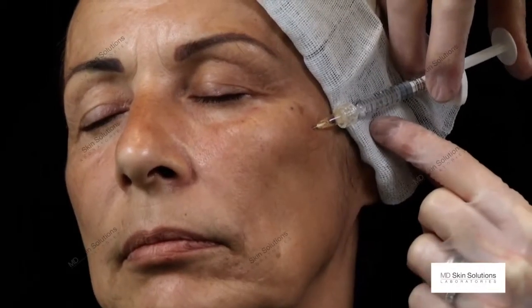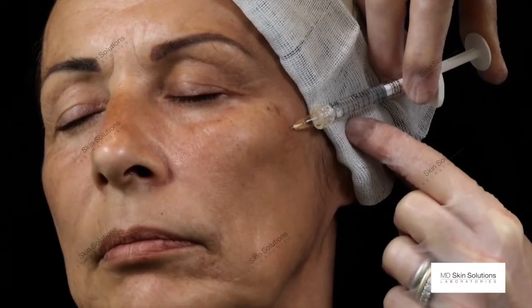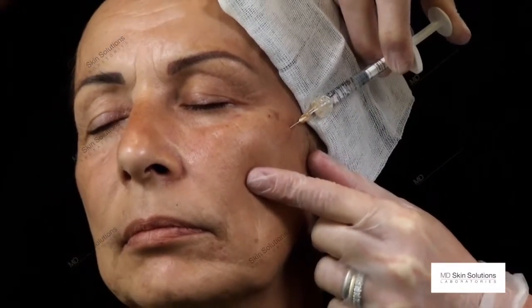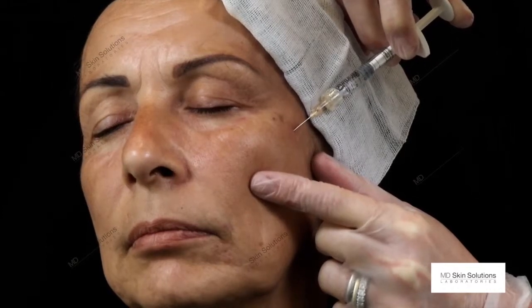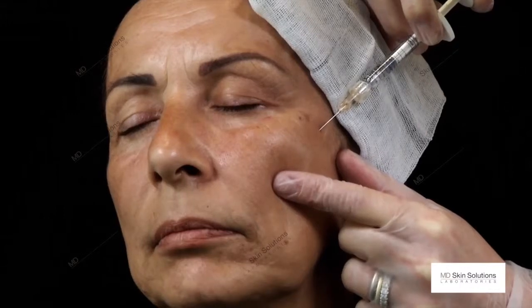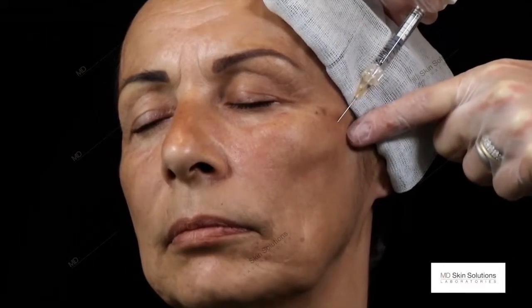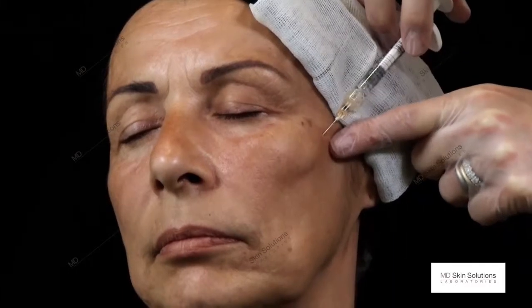I inject 0.1 as a bolus, and now I withdraw the cannula and the syringe while injecting Pluryal volume in a retrograde way in order to redefine her lateral OG curve, give her a lateral lift, and see how that forms a nice curve already.